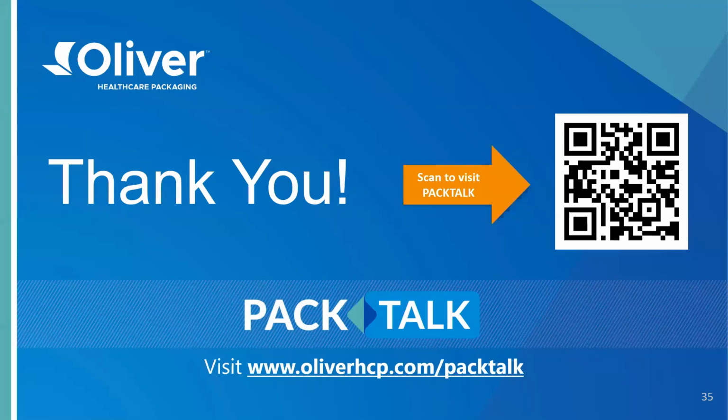There's another question here. If the package has gone through sterilization, why is there even a possibility of a non-sterile particle? I guess I'll start with that one, Tommy, and then please chime in. If it's gone through sterilization, it doesn't mean, for example, if it's a single barrier system, that only guarantees that the inside contents of a sterile barrier are sterile. During other exposures to the environment, the outside could become contaminated one way or another. Yep, agreed.